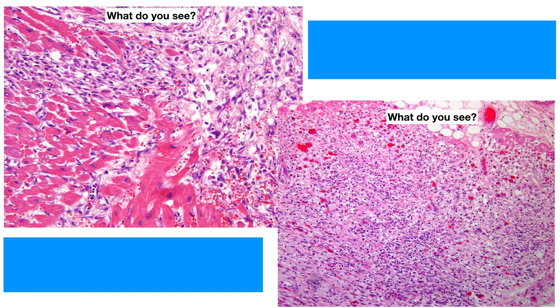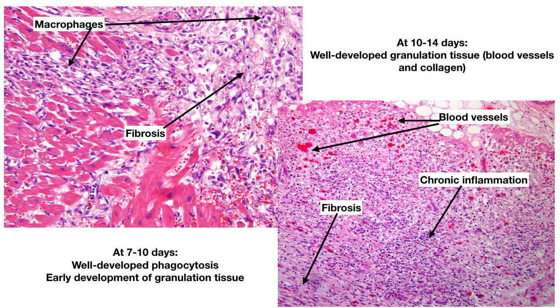On the left side, at lower power, you can see the macrophages and also some degree of fibrosis — a trichrome stain would bring that out — with strand-like material in between the cells. On the right side, it is much better developed: you can see some inflammation, blood vessel formation, and fibrosis; the acellular pink material in between would stain with trichrome. At 7 to 10 days, you see well-developed phagocytosis and early development of granulation tissue. At 10 to 14 days, you see well-developed granulation tissue, blood vessels, and collagen — once again showing a spectrum.